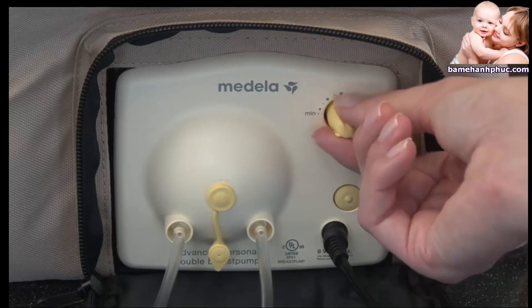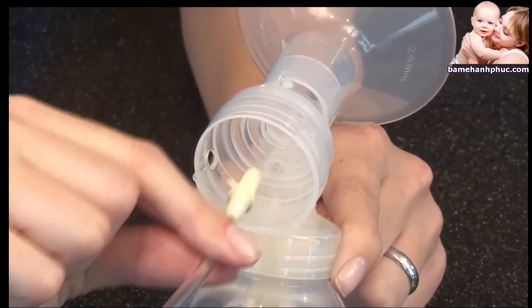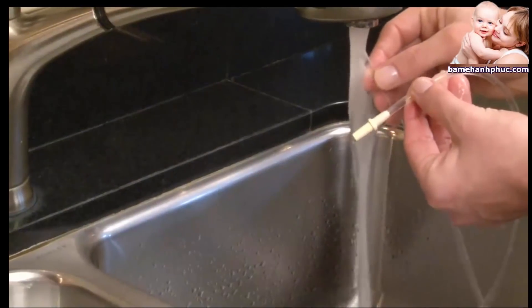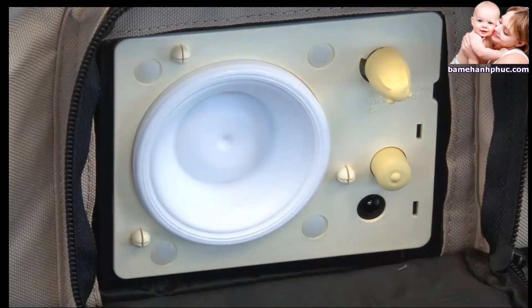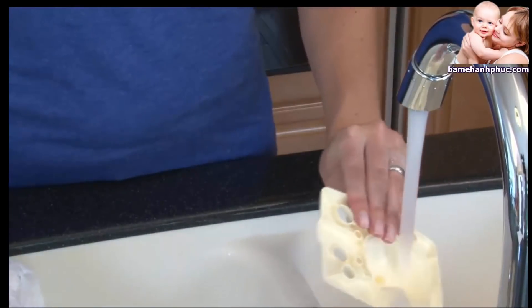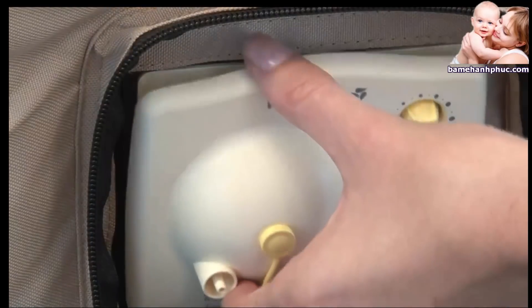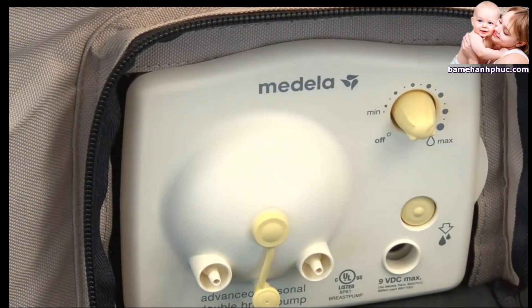If milk gets into the tubing, turn off the pump and unplug the transformer from the unit and wall outlet. Remove the tubing from the pump and breast shield connectors, rinse in cold clear water, and wash in warm soapy water, then rinse again in cold clear water. Then detach the face plate using the thumb tab on the right side. If there is any liquid behind the face plate, wash it in warm soapy water and rinse in cold clear water. Use a damp clean cloth to wipe the pump diaphragm. Let the face plate and diaphragm dry completely, then reattach the face plate by pushing it until it snaps into place. The face plate needs to snap securely at all three connection points to ensure adequate vacuum and optimum pump performance.